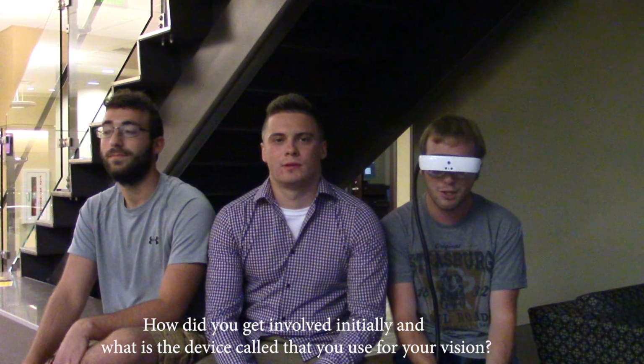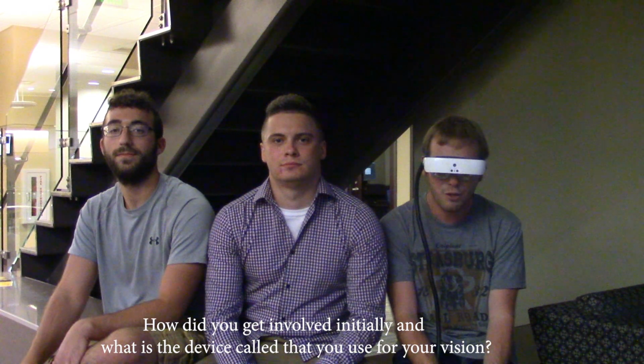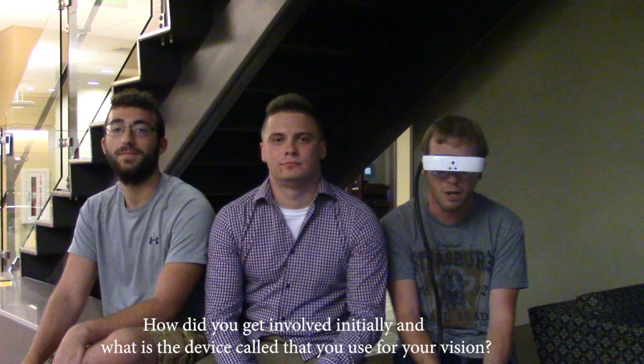Then your second question, this awesome device I'm wearing is called eSight. It is a medical device to help vision impaired people see better.